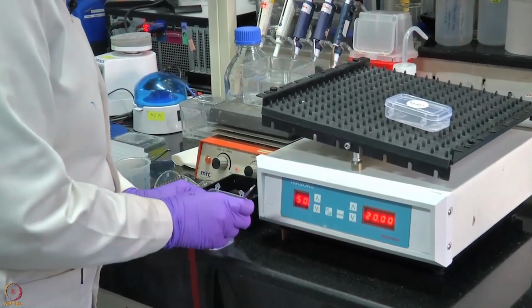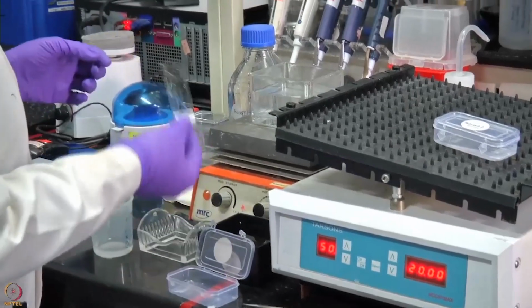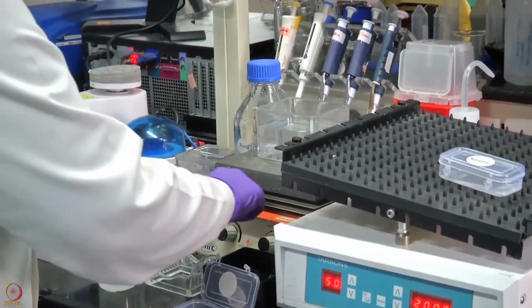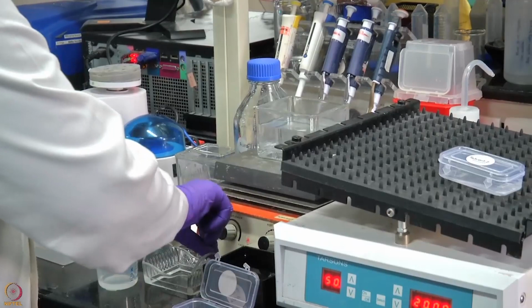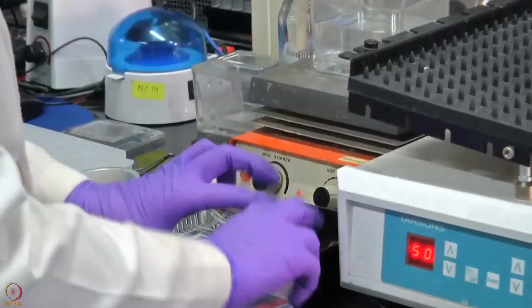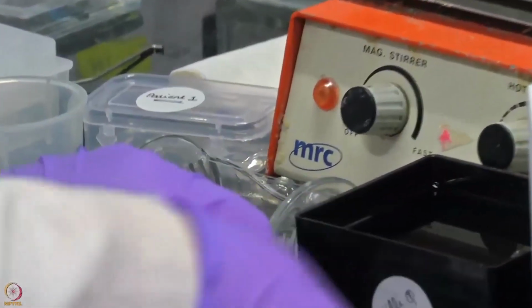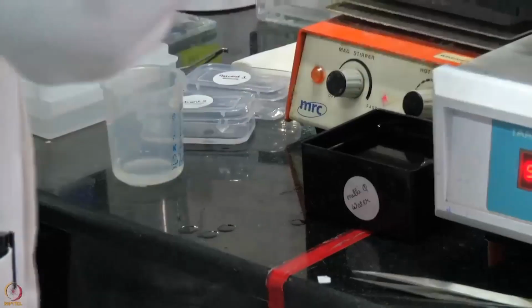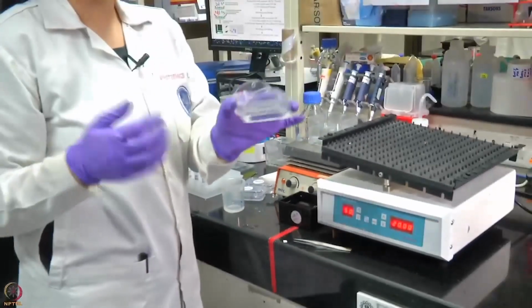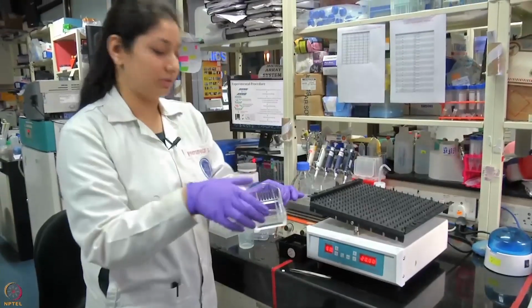For that, you can just touch the slide at the barcode region, and then we place the slide carefully into the cassette. This is the cassette where we place the slide for washing. We will do the same for the other patient. This is how the cassette looks, and we keep the slides with the protein areas facing each other.